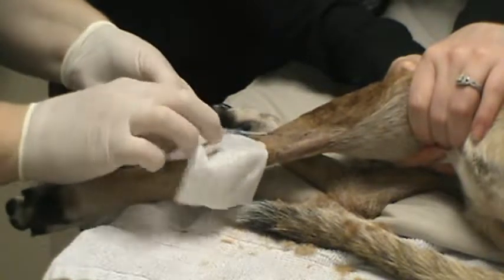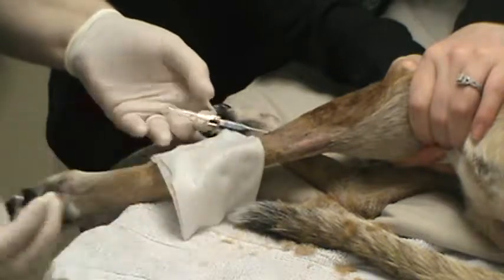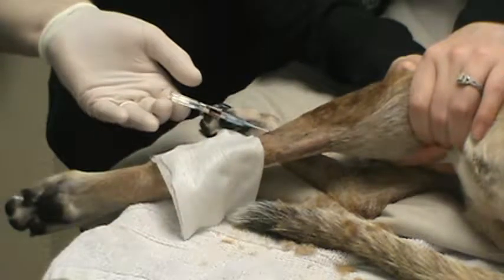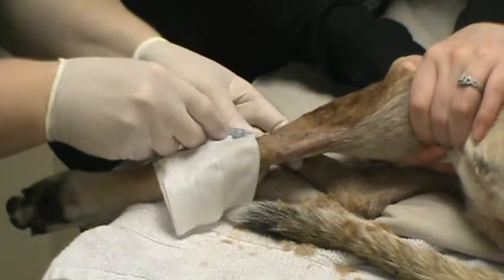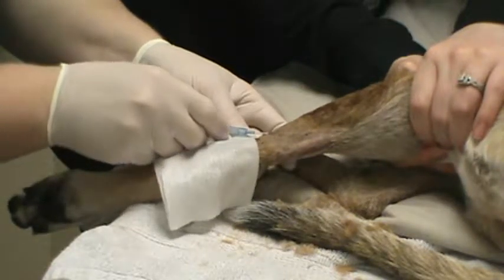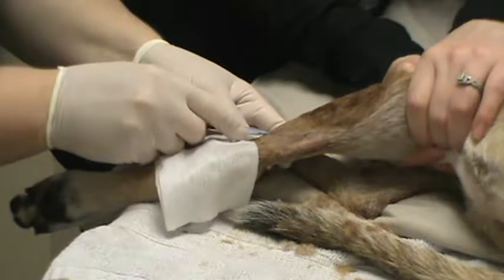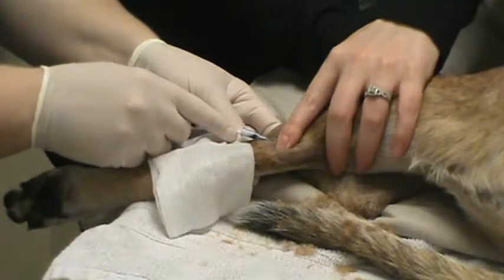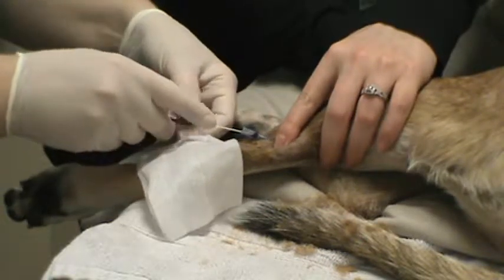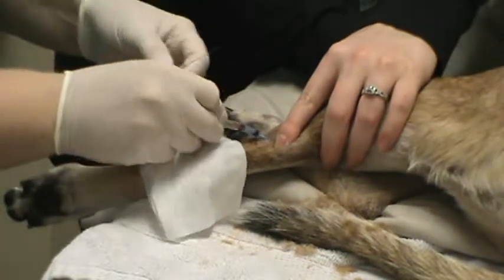Yeah, so we have blood flash there. You can see that in the video. So we have blood coming up into the catheter. Advance it just a little further and then slide it off. I have my assistant hold off the vessel so it's not going to bleed. Put that cap on it real quick.